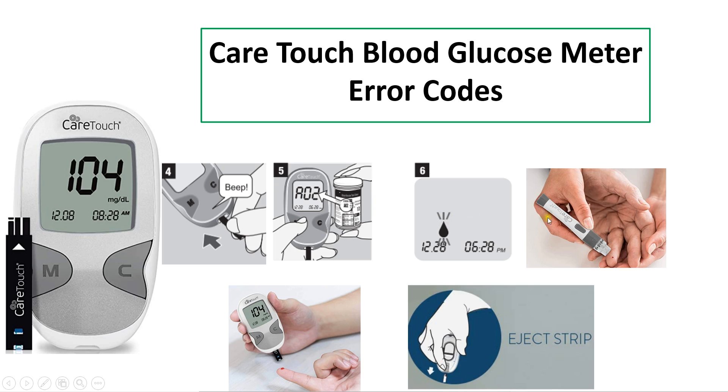If the codes match, the meter displays the blood symbol, meaning it is ready to perform the test. Use the lancing device to puncture the finger and obtain the required amount of blood. The test strip has a capillary which draws in the required blood. After enough blood is taken, the meter produces a beep sound and a countdown starts from 5 seconds.